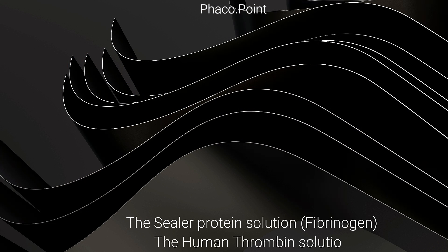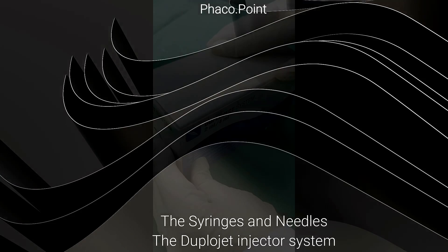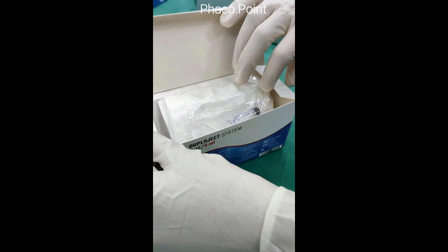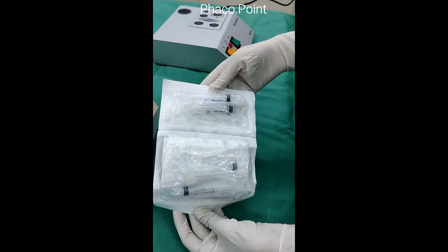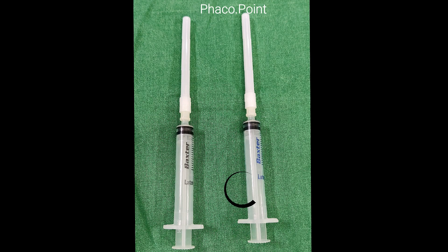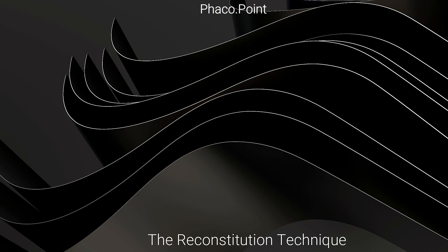When properly reconstituted, the two solutions are: the sealer protein solution and the human thrombin solution. The second box houses the syringes, needles, and the Duplojet injector system — all required for preparing the solution to avoid any premixing. The blue syringes with blue writing are used for the blue-topped bottles, and the black syringes with black writing are used for the black-topped bottles.